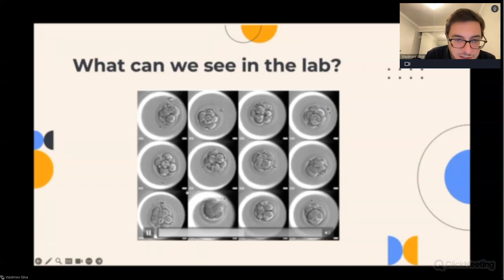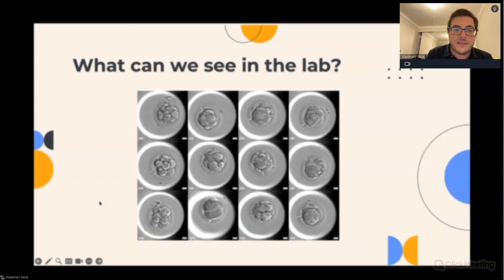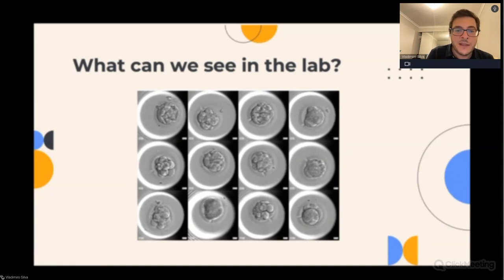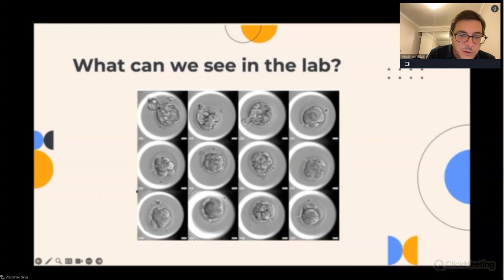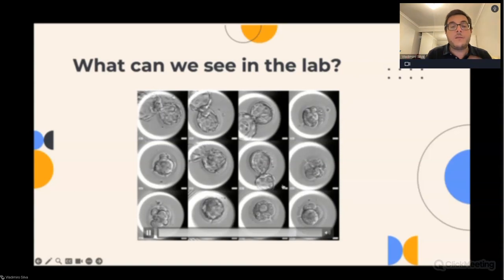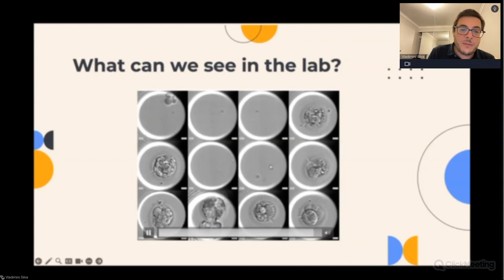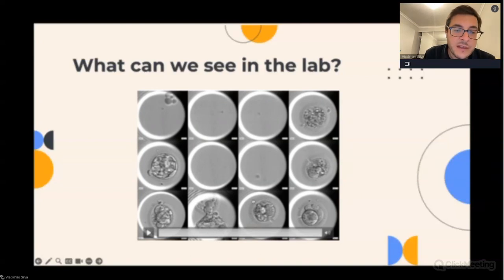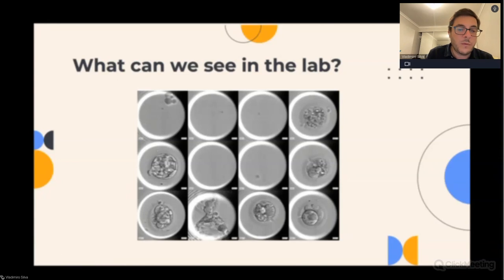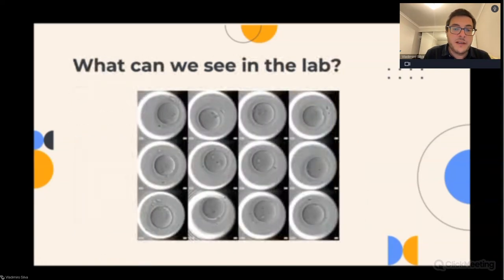Maybe you can't see it here, but we have the time that has passed. For example, now we are at 80 hours post-fertilization, and we can see the embryos developing. Now we are already on day 4 and almost on day 5, and we start to have the blastocysts. The embryos that started with just one cell divided into 2, 4, and so on. For example, these 5 embryos were taken to be frozen. These ones here were left under observation because there was something wrong with them that was identified with our techniques in the lab. As you can see, this is extremely complex.